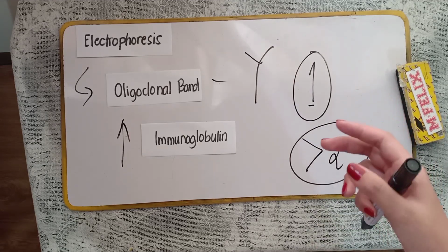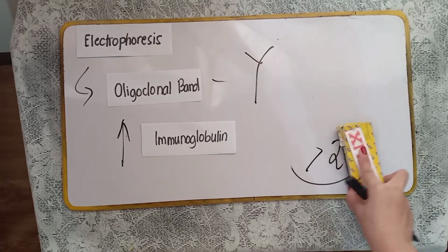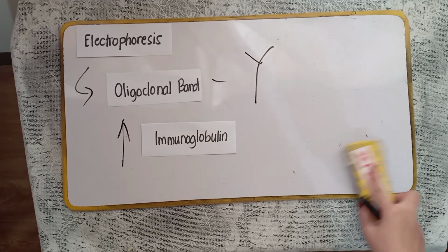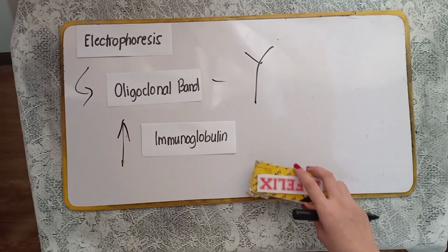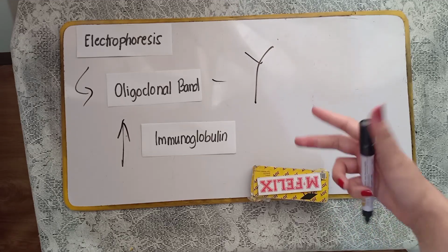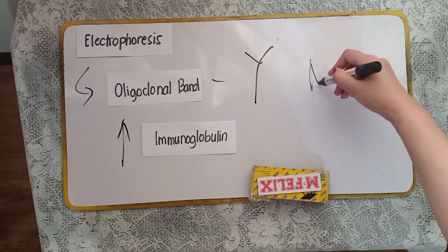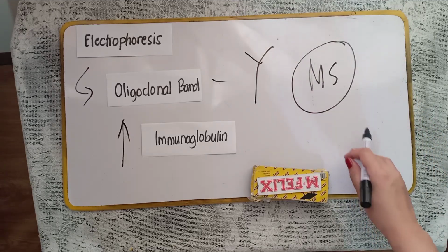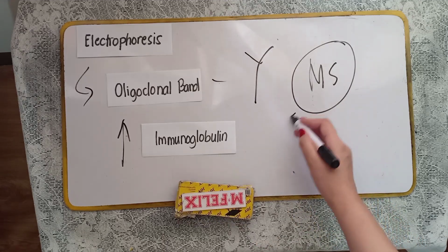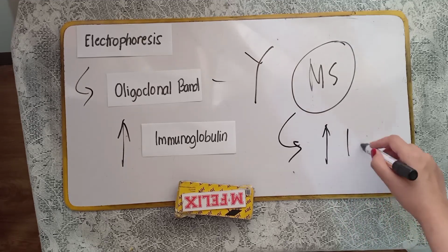a definitive testing. Now, again, ang clinical significance ng ating oligoclonal bands, it is an indication of an inflammation process within the CNS. Okay? Then, aside from this one, it is usually useful as an aid in the diagnosis of multiple sclerosis. Multiple sclerosis. Kasi, ang important marker din ng multiple sclerosis natin, usually tataas din ang kanyang immunoglobulin production. Especially yung ating IgG type.